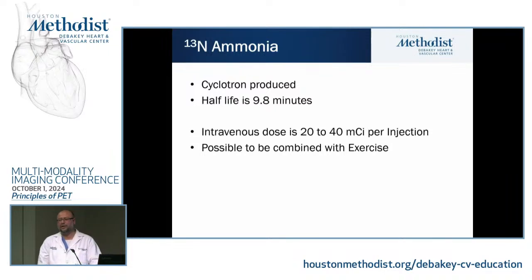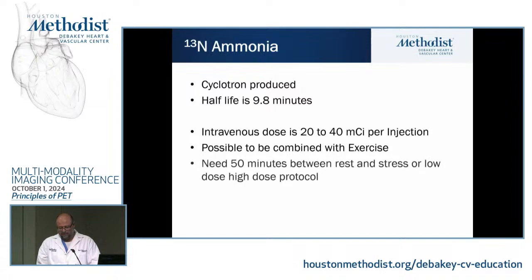half-life, you can potentially, theoretically do exercise. It's feasible. It has been shown in a few studies, but nobody is doing it because it's clinically cumbersome and it's associated with exposure to the staff also, because once you inject the radioactivity, you still have to position the patient from their treadmill and go ahead and inject.